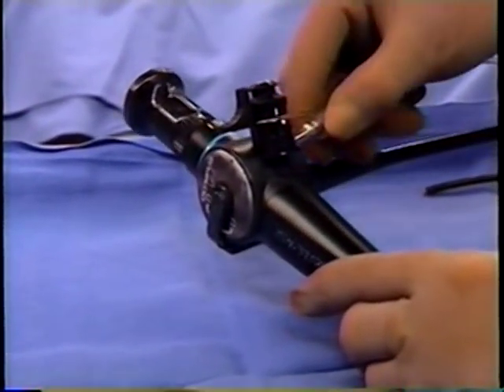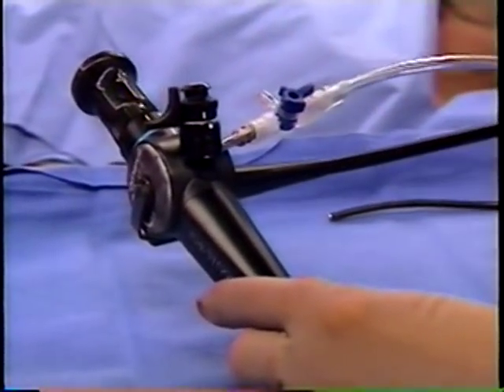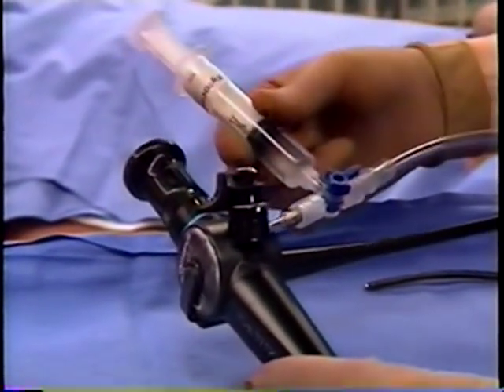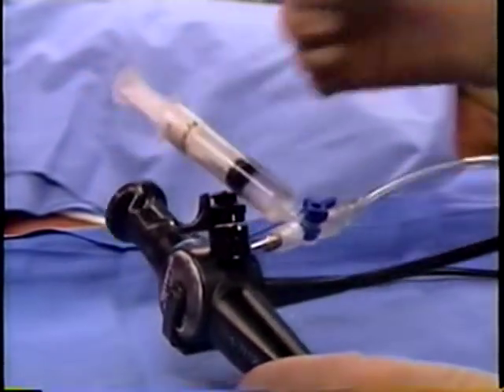The second spray-as-you-go method uses a triple stopcock attached to the proximal portion of the suction channel. Oxygen tubing is connected to the distal port of the stopcock and set to flow at 2 to 4 liters per minute. 2% or 4% lidocaine can then be injected through the remaining port and is nebulized by the flow of oxygen. Management of the difficult airway begins with identification of susceptible patients. Appropriate preparation produces a comfortable cooperative patient who will tolerate subsequent intubation with minimal pain or tissue trauma. Most importantly, successful awake intubation has the potential to reduce respiratory-related morbidity and mortality.